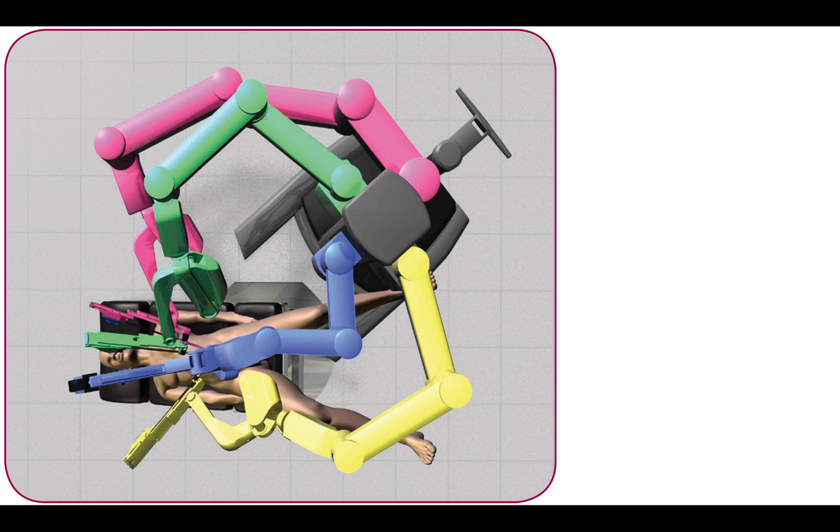For the Si robot, once it's docked, the camera arm needs to be broken to the right, and the number one arm also needs to be broken to the right in the same direction. The number two and three arms are broken in the opposite direction, with these large joints giving you adequate distance between all of the robotic arms.